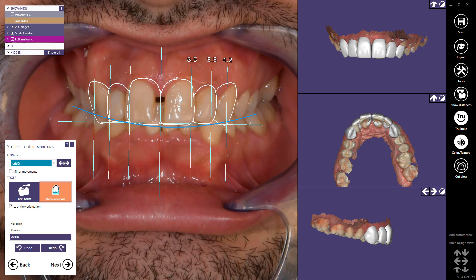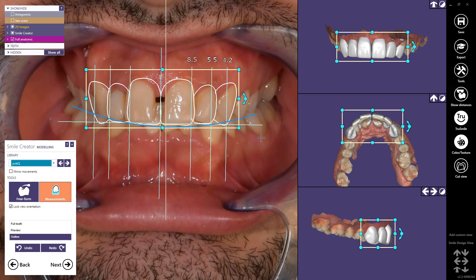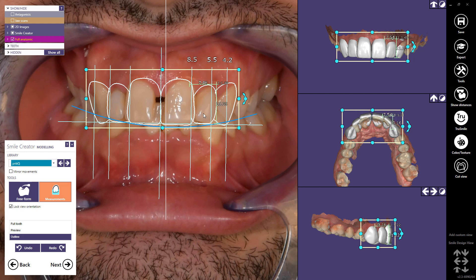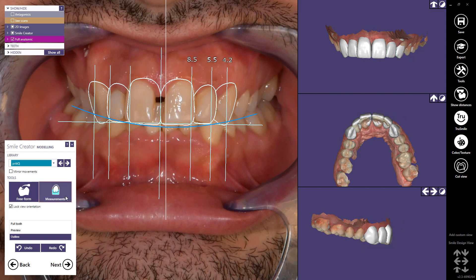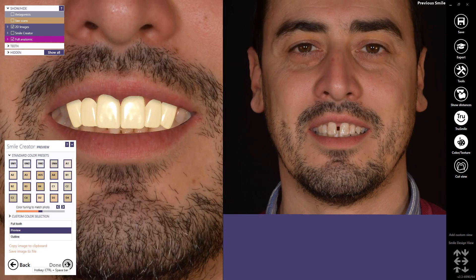Click on the Measurements button to display the measurements and ratio of each tooth. When you've finished the tooth placement, proceed to the next step.